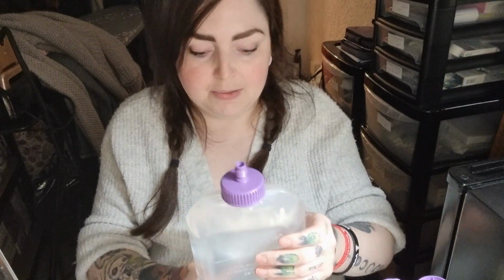Also, water. This is where I get my water from. I don't drink it like this. Nope. I drink it through my belly. And I eat through my belly. So this is just sterile water, from the kettle. So boil the kettle, let it cool, pour it in here. I use 2 of these a day. So it's nice and clean.